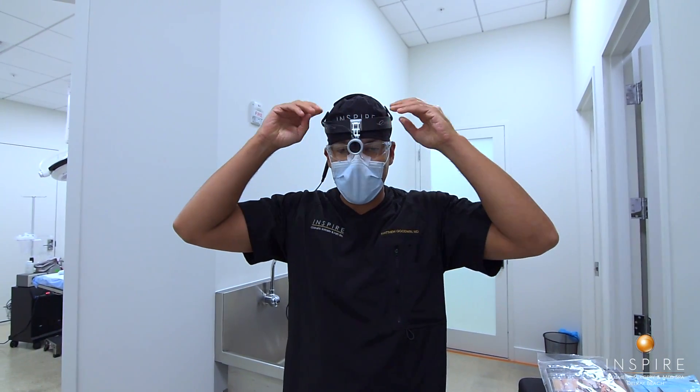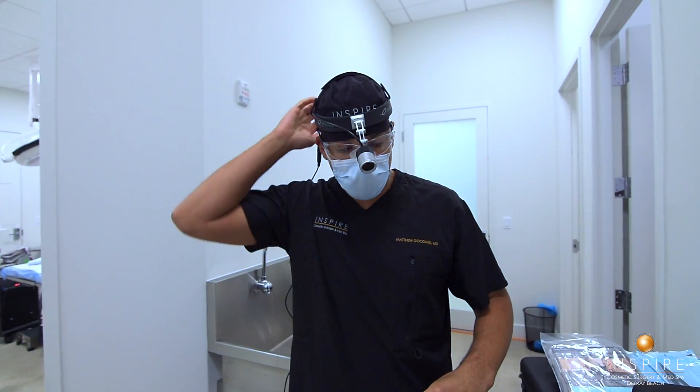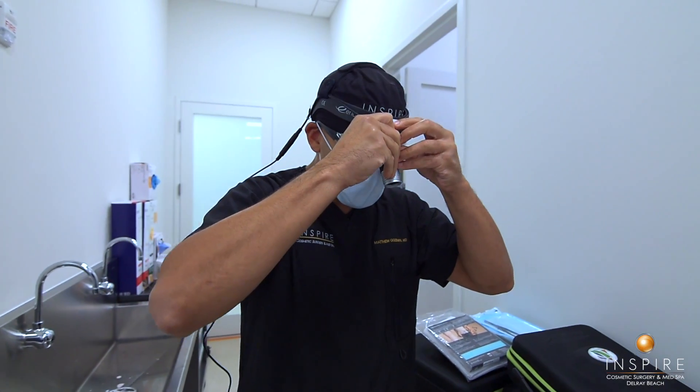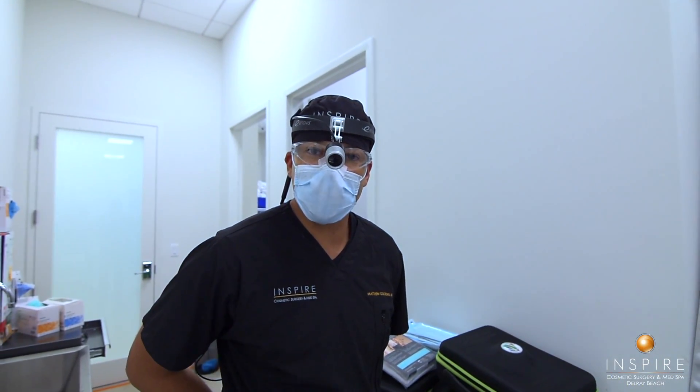I like to use a headlight to help me visualize. I'm using a pretty small incision to access the implant pocket, so I'll be doing a dissection in there, and the headlight helps illuminate every place I'm working.